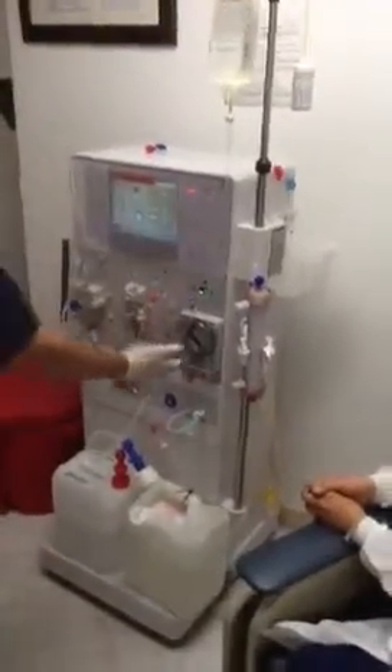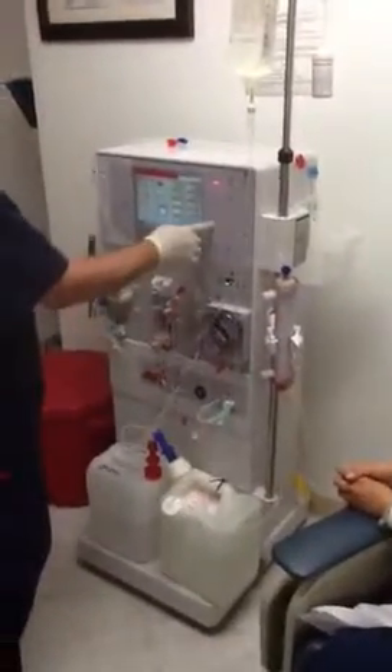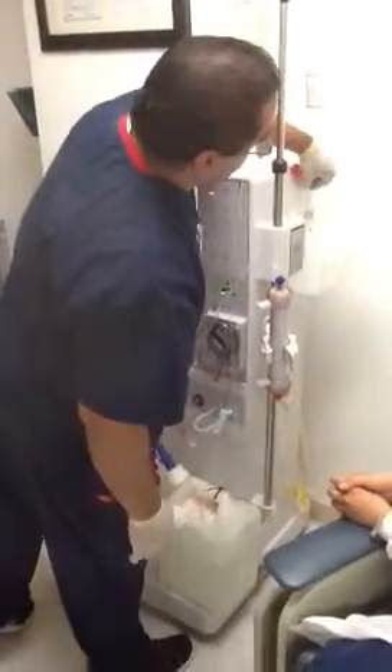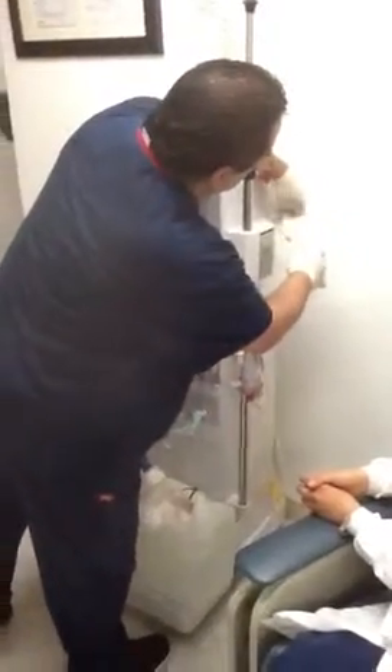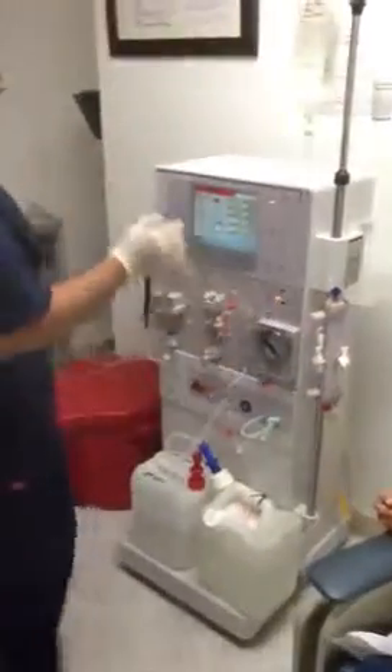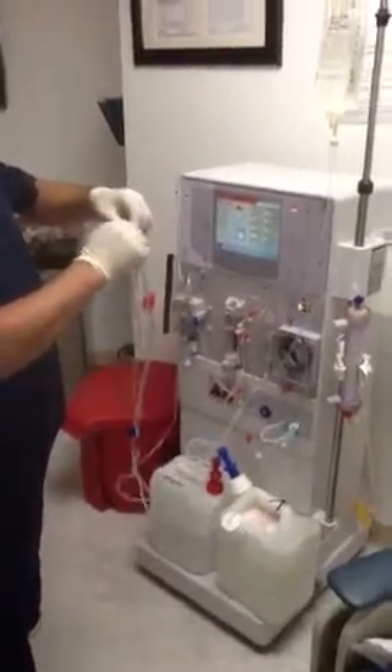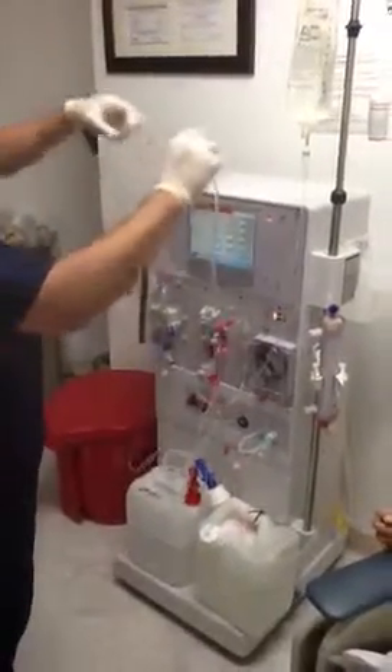The priming stopped — you can tell when the blood pump stops and the light goes out. Once that stops, clamp the venous line that's in the bucket. Pull them out and connect them together. Once you connect them, unclamp.